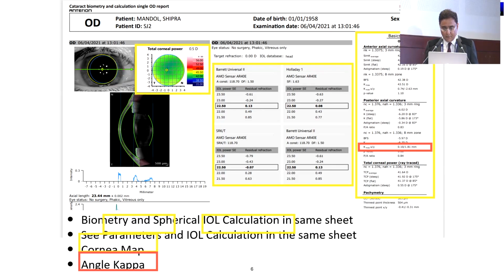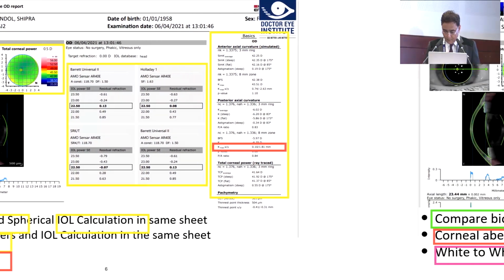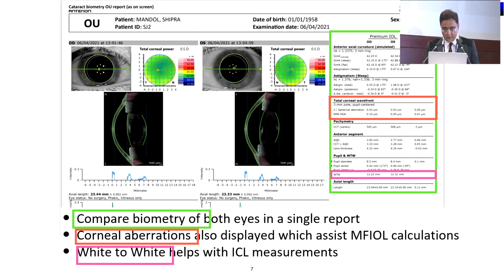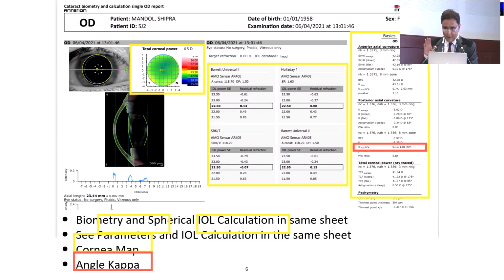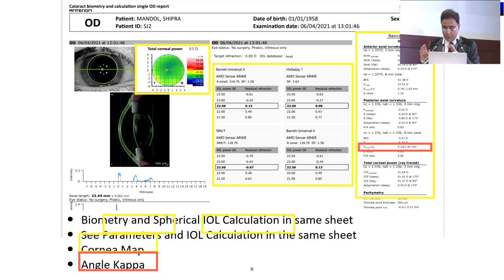So this is one example, where I'm showing no financial interest, where I'm showing anterior analysis. He spoke about the IOL Master 700. Here it is important that we get all the calculations. Here you can see that all the calculations are together. So you have the right eye and the left eye for comparison. You have total corneal power. The anterior corneal power and the posterior corneal power are different in post-refractive cases, right? So that's what we want to understand.